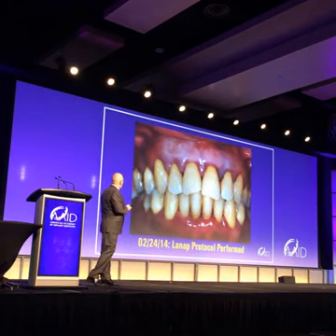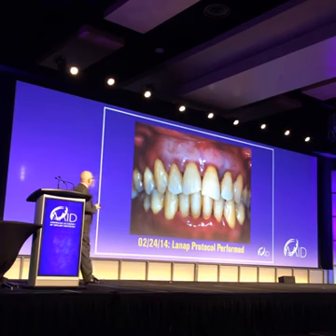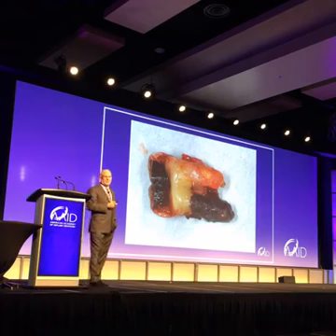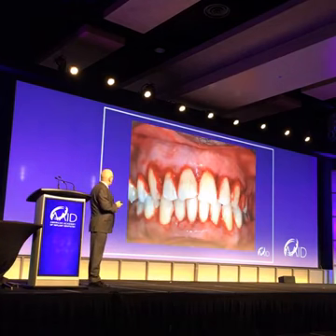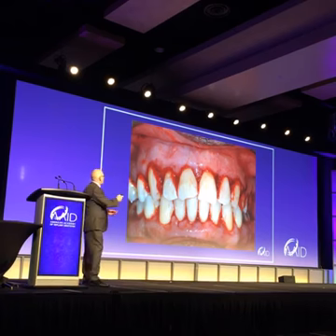So this is what he looked like when he was treated. This is not after treatment, obviously. This is the day he came in. We did his treatment. This is one of the teeth I took out. You can see the calculus that I was trying to fight to take off. Here he is, right after treatment. The blood you're seeing, that's our fibrin clot.